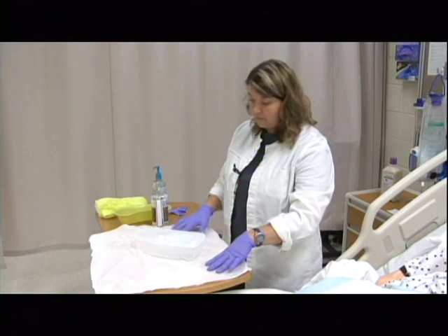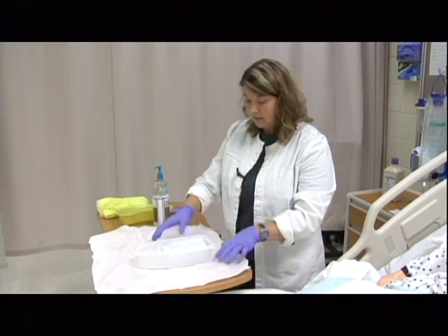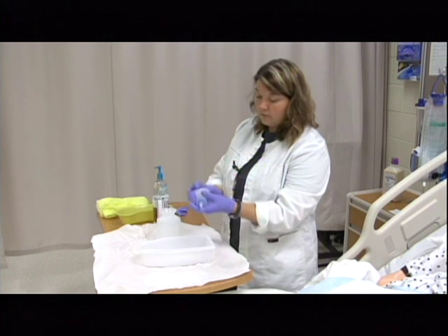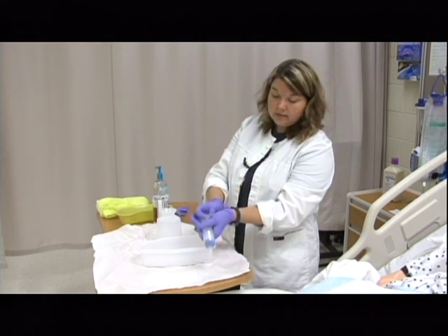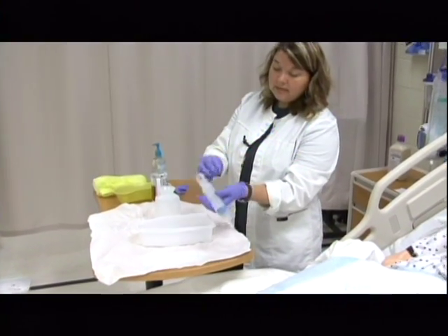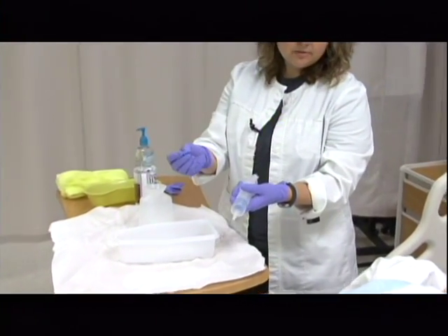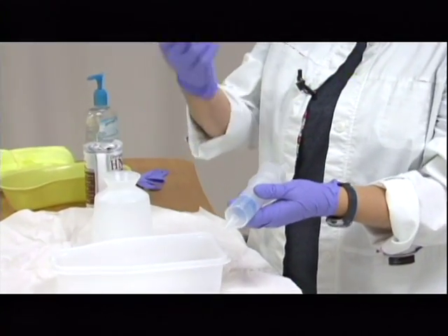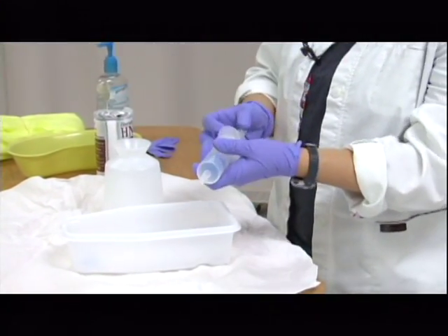As I open up this set, I'm going to go ahead and assess it for equipment. Again, this is not a sterile field. It does not have to stay sterile. It's not a sterile procedure. As you look at the kit, you need to make sure that you're assessing for it. You should have a piston irrigation syringe, and you'll see it has markings on it. They do have an extra little piece here for the length, and some of the gastric tubes may have smaller connecting points that you might need this. So I usually put it down in the tray and come back to it.